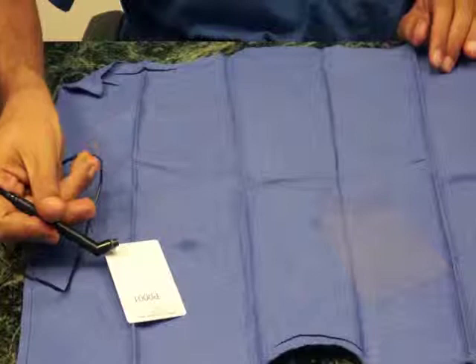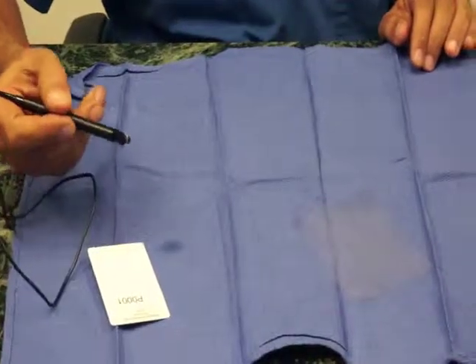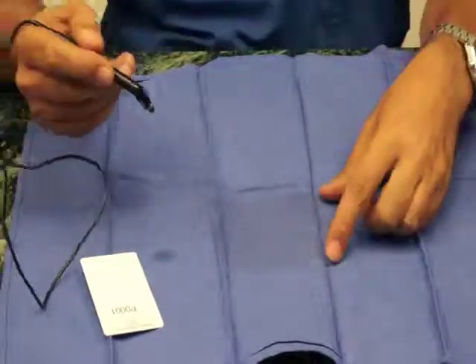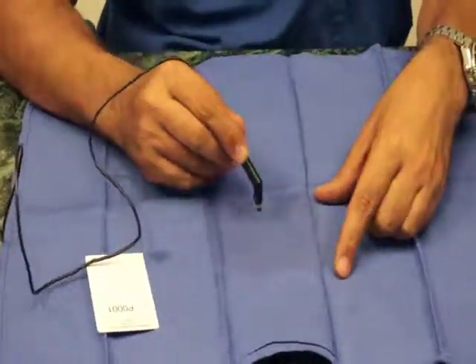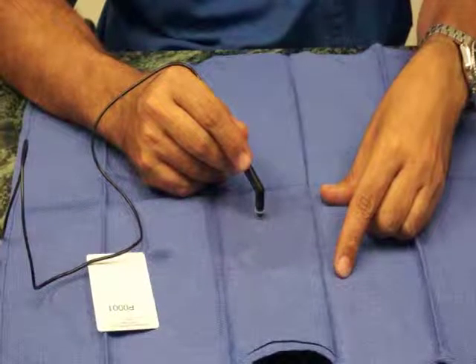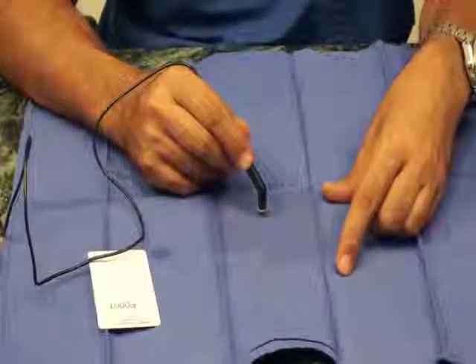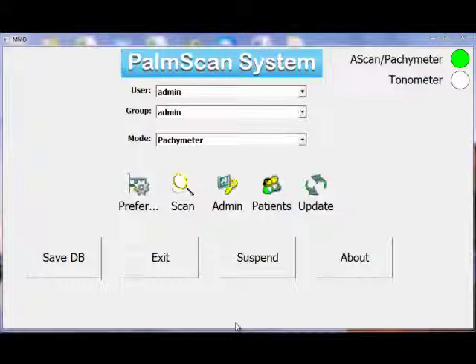The way that the new system captures is it waits until you place the pachymeter and the tip on the cornea before starting the capture process. Now that I've shown you how to properly put the pachymeter tip cover on top of the transducer, we're ready to actually scan some samples.